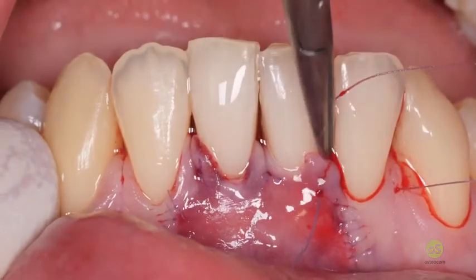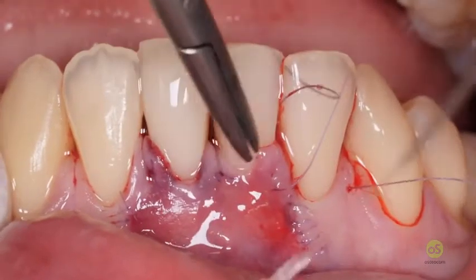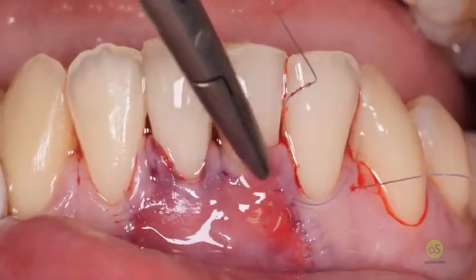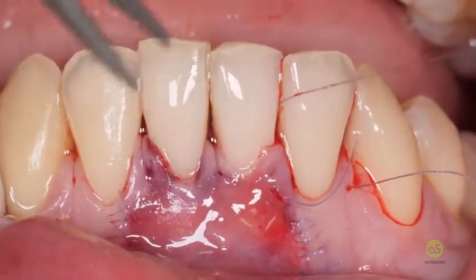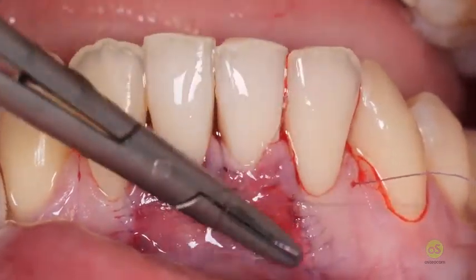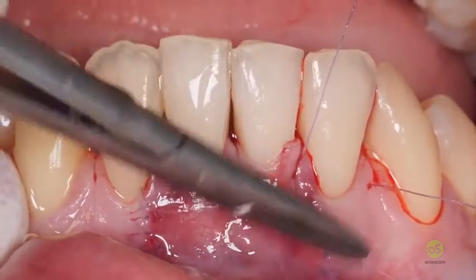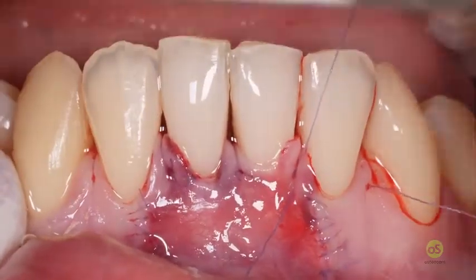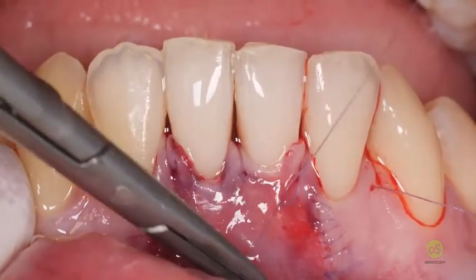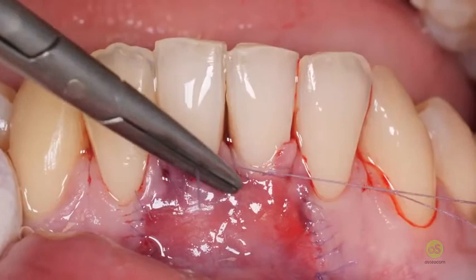I don't have to see anymore. Right. Clean it. You don't have to see any sign. You see now it's well positioned. And now this can be pulled in the middle, but with no more tension because the vertical release incision is completely closed.